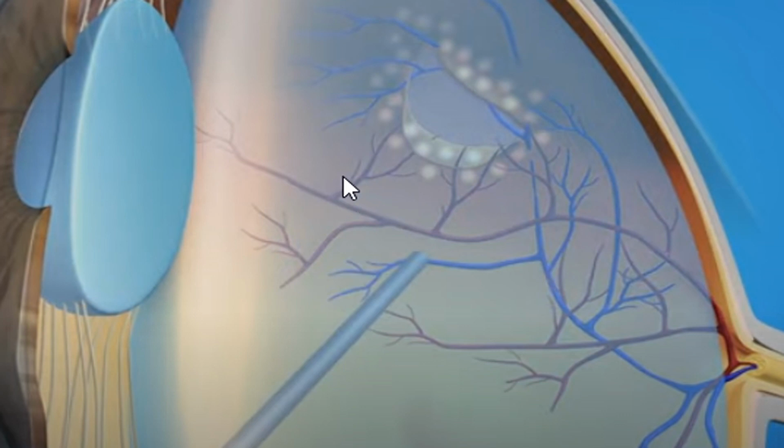Actually, silicone or heavy fluids or C2F6 or C3F8 or whatever you're using, all of them are called tamponades. And from its name, we use tamponades as vitreous substitutes for pressing against the detached retina to avoid any other complication or recurrence.